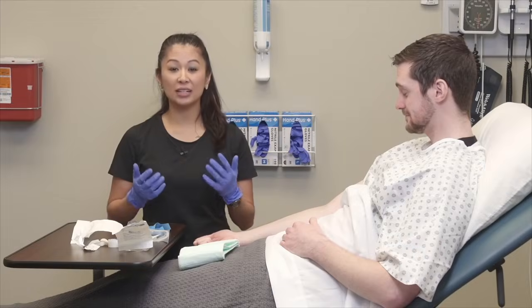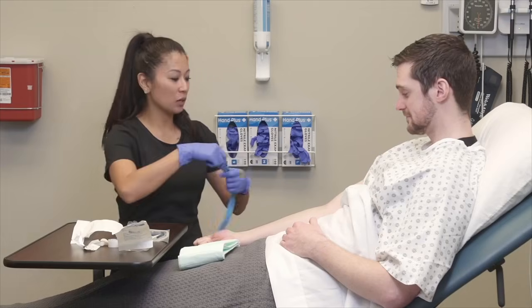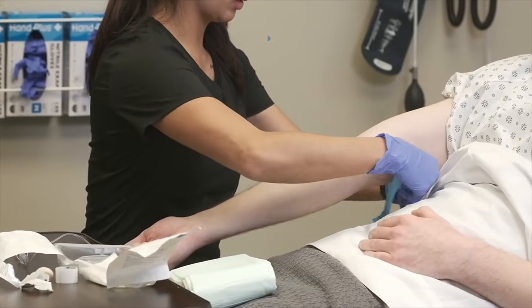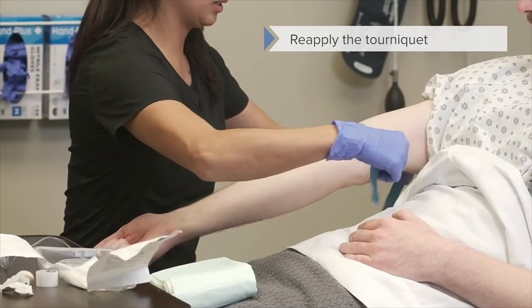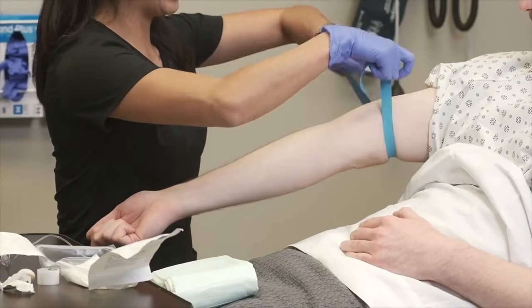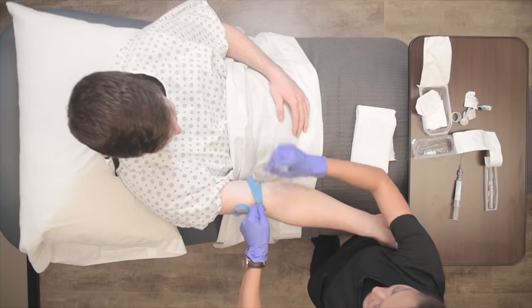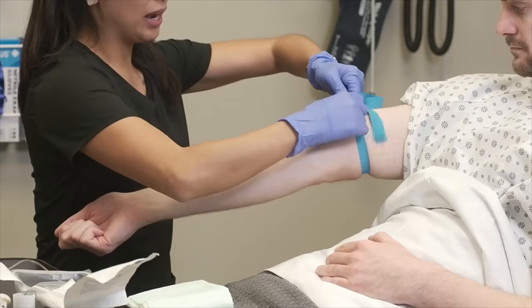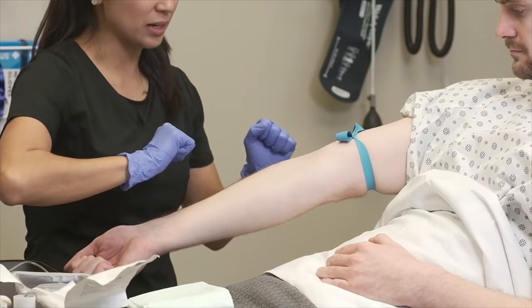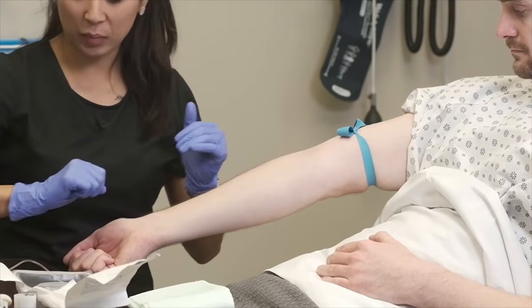Okay, so we just identified our vein and we clean. So now we're going to move on. I'm going to go back to reapplying the tourniquet. And if you guys remember, we're going to hold this nice and taut. Whoop, a little too taut. Nice and taut. And then cross this over. And then I'm going to hold and support it with my finger here, make that X, and then loop this back through. So this can be nice and quick release when I need it. Notice I've put this a little bit higher up on the arm for my patient.